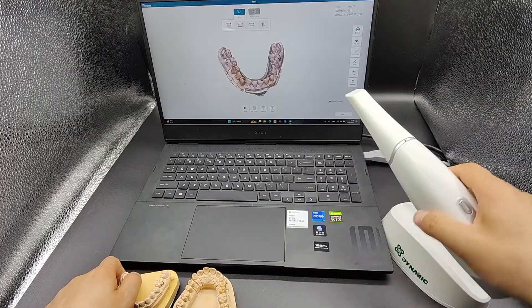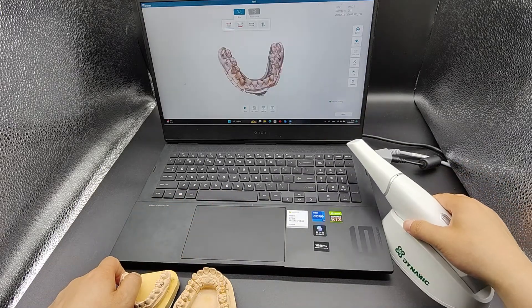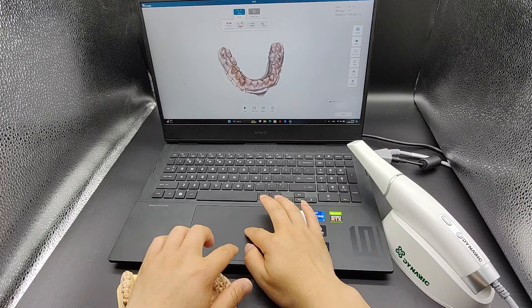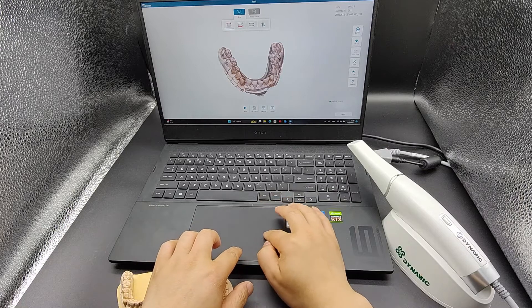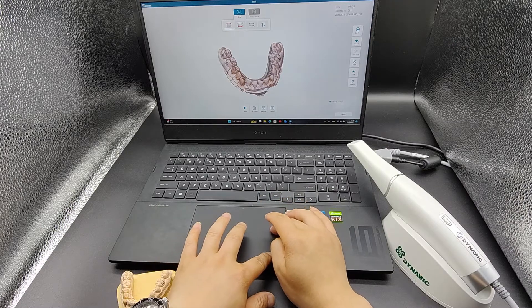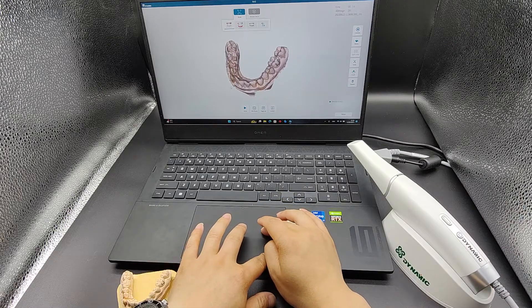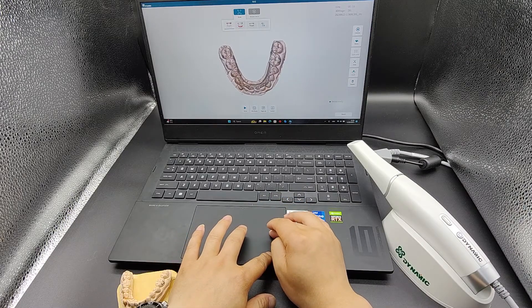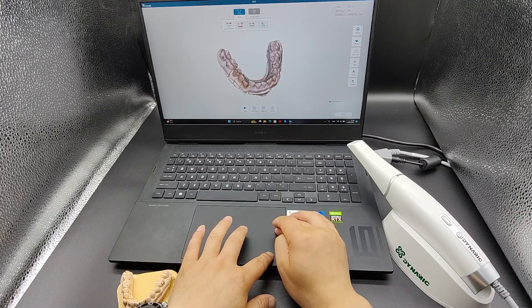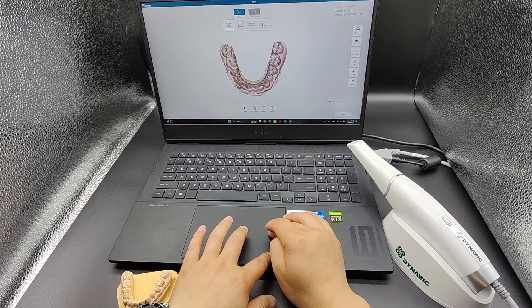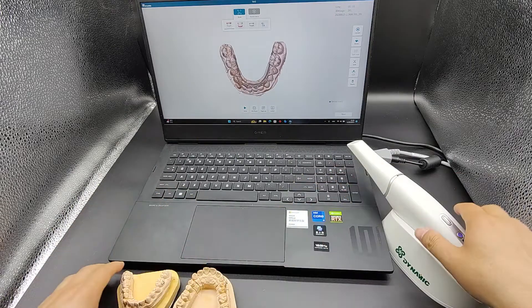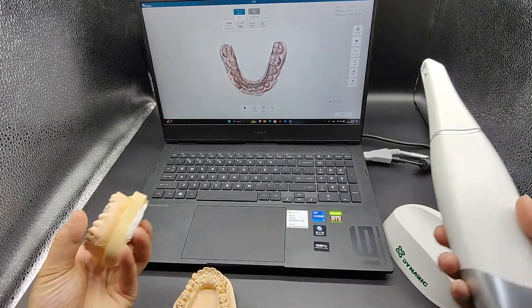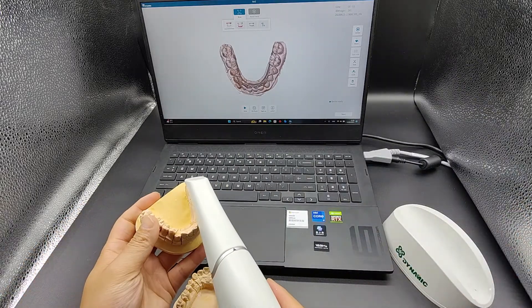Use the right mouse button to rotate the model and check if it has been scanned completely. If there is a need to re-scan a certain area, place the tip on the area to be re-scanned and scan it again.